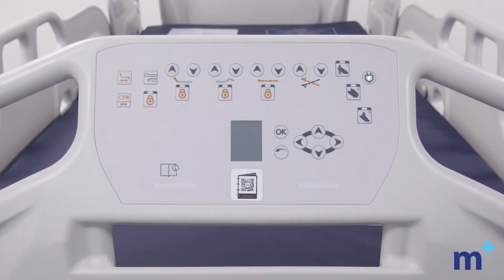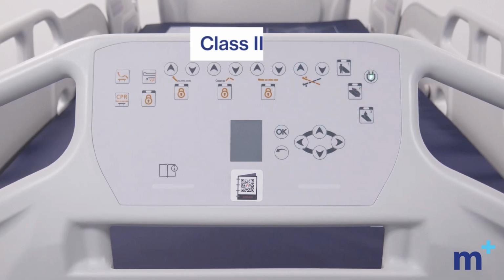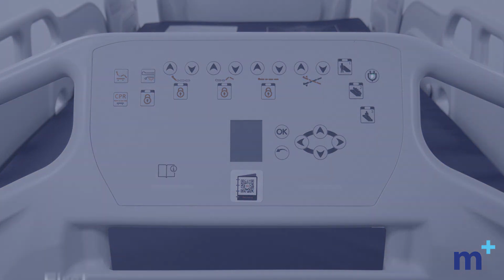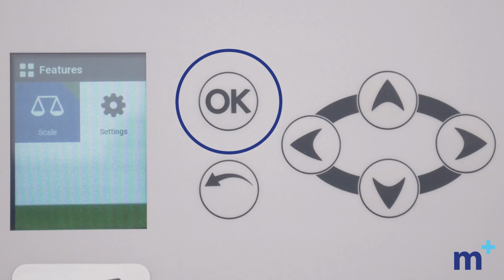The Versatech 700 incorporates Class 3 weighing scales to facilitate easy and frequent patient weighing. Scale controls can be accessed via the Footboard. First, ensure that all necessary equipment, such as pillows and bed linen, is in situ. From the main menu, select the scale icon and press OK to access the scale menu.